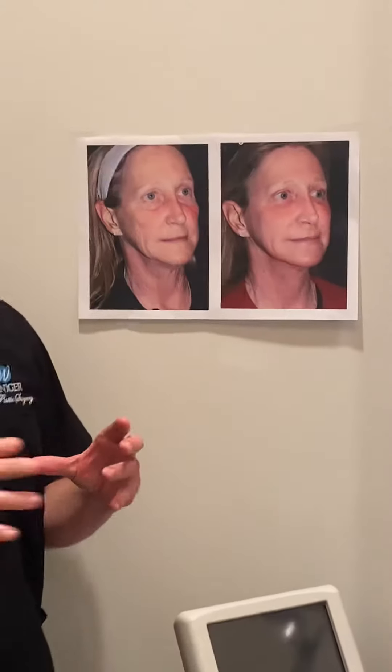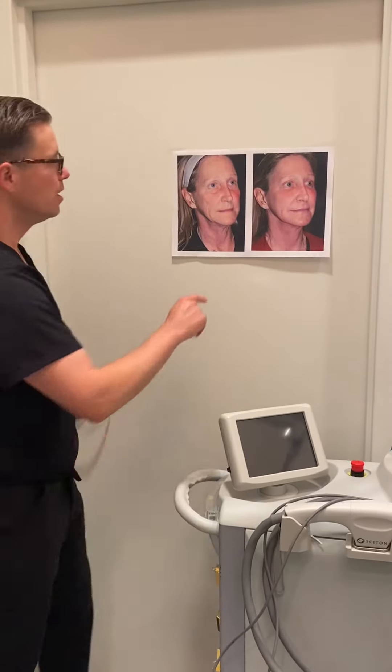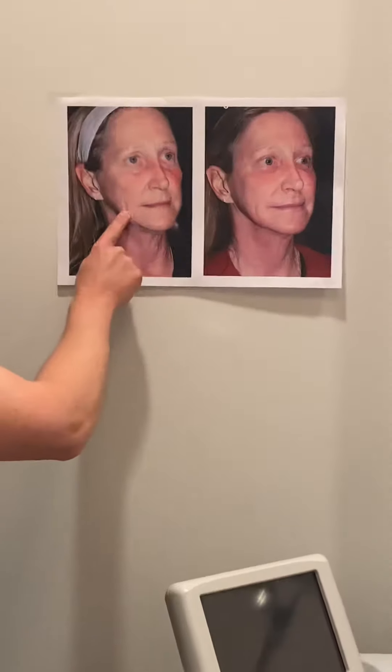The other thing we did is with laser resurfacing — not only did we improve the wrinkles, but the heat that we're applying also gives a shrink-wrapping effect to the skin. So you can see all the tightening effect that we got down through there.